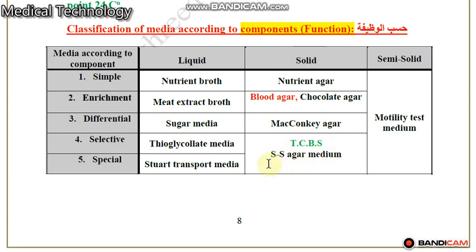This is selective media for Salmonella and Shigella bacteria. Special media, for example, Stuart transport media or Palcam agar for Listeria, etc.